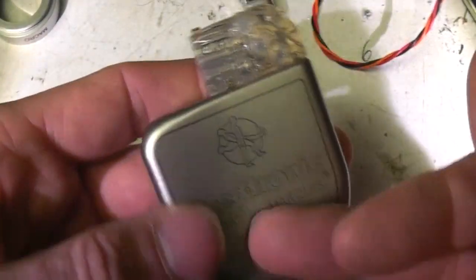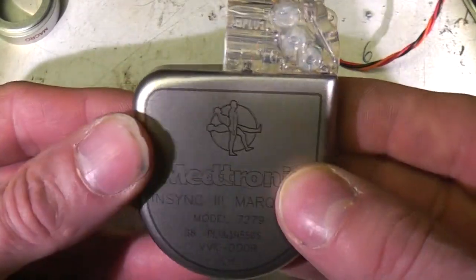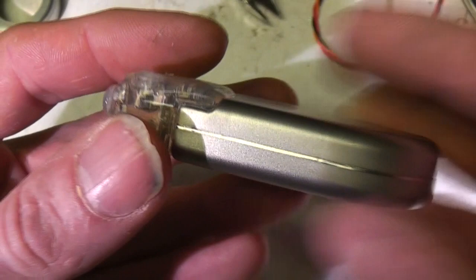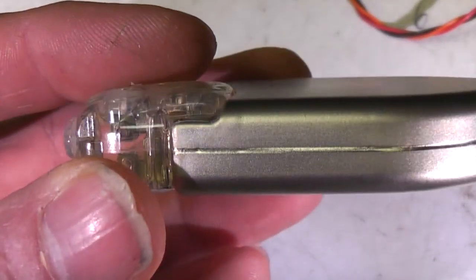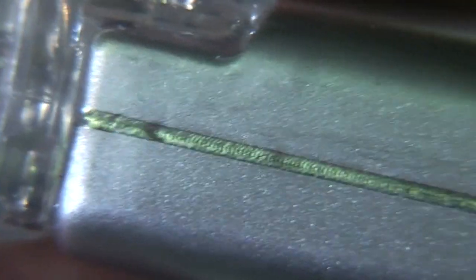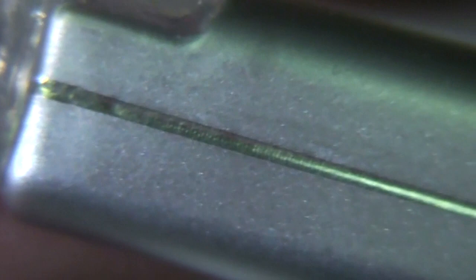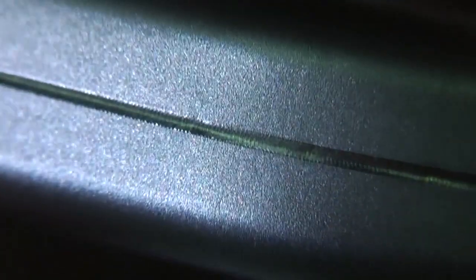So this metal can, I'm guessing this is probably titanium, because I believe titanium's got very good biocompatibility. It looks like it's been welded around the outside. This case looks like it's been welded. I'm guessing it's probably been laser welded, certainly some sort of robotic automatic process to produce a nice clean weld all the way around the edge.